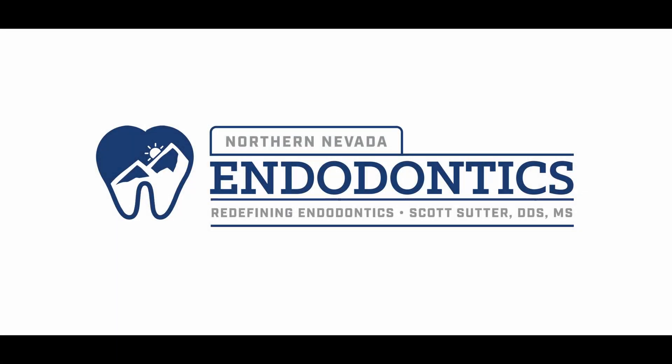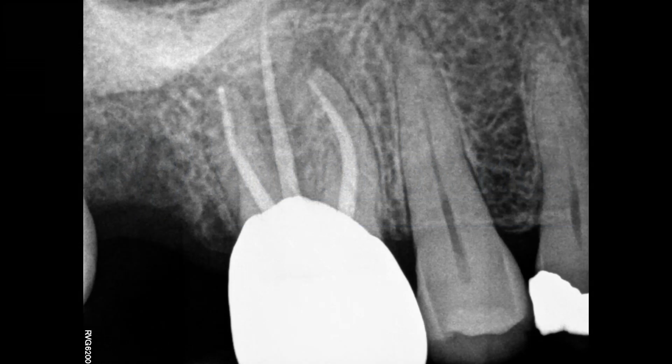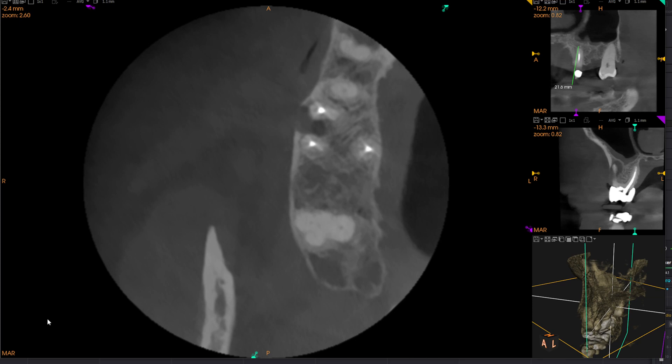Hello everyone and welcome back. Another interesting one for you today. So here's the tooth. You can see that there's something going on on the mesial. You're guessing it's the same as mine — it's probably a missed MB2.